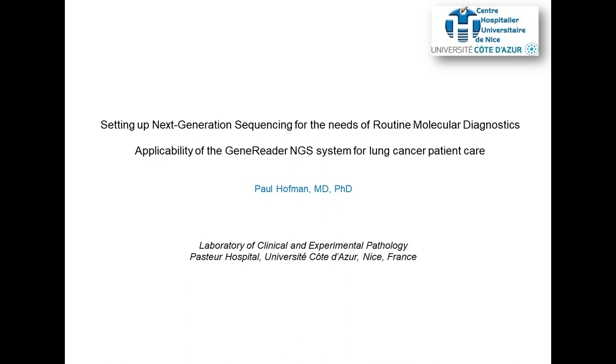So it's very important to have these results in one step. I mean, to try to detect all the mutations and all the rearrangements through an NGS system. I think it's very important to improve the possibility for our patients to have the best therapy.